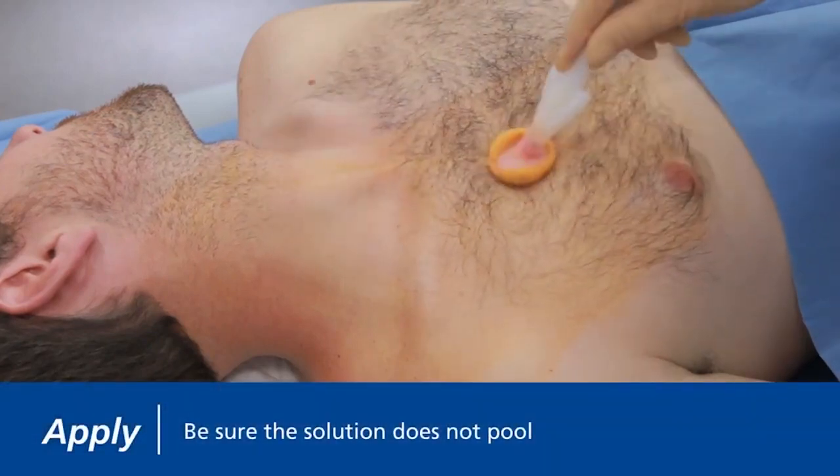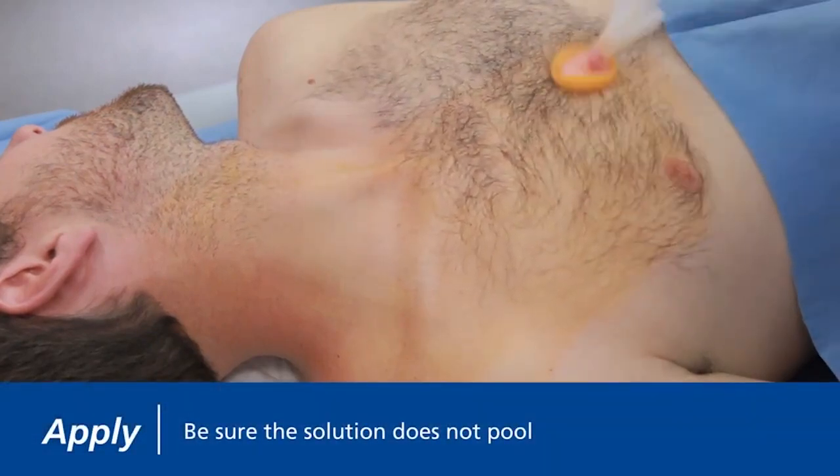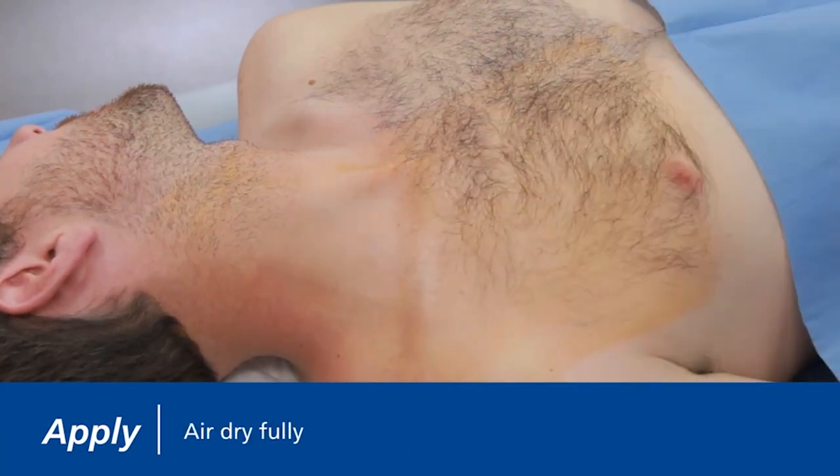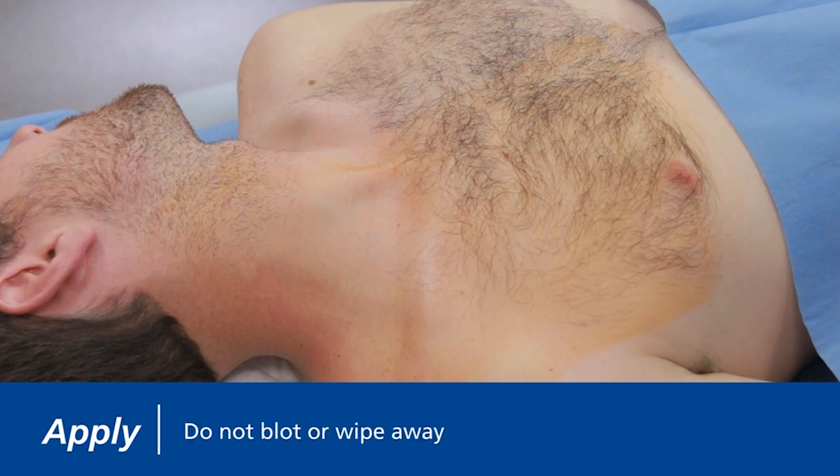Be sure that the solution does not pool under the patient. Remove wet materials from the prepping area. Allow the area to air dry fully. Hairy areas require more time to air dry. Do not blot or wipe away.